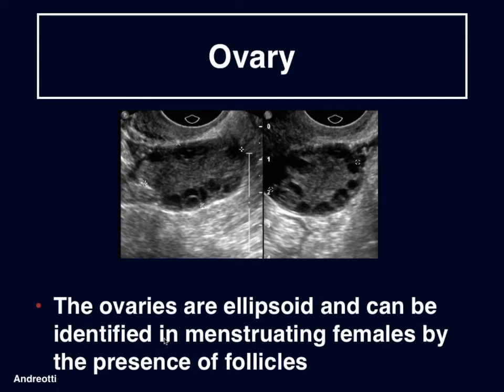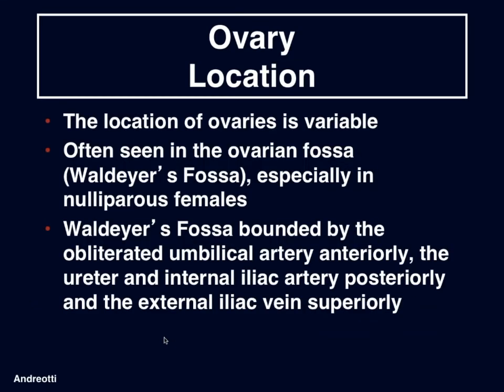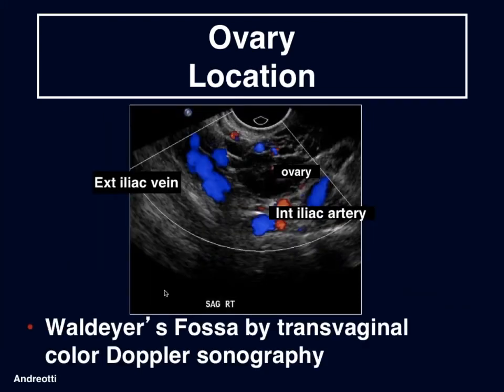Moving on to ovaries. These are ellipsoid structures and can be identified in menstruating females by the presence of follicles. The location of the ovaries is variable — often seen in the ovarian fossa, which may be called Waldeyer's fossa, especially in nulliparous patients. Waldeyer's fossa is bounded by the obliterated umbilical artery anteriorly, the ureter and internal iliac artery posteriorly, and the external iliac vein superiorly. Here we have a nice sonographic depiction of Waldeyer's fossa, with the ovary bounded posteriorly by the internal iliac artery and superiorly by the external iliac vein.